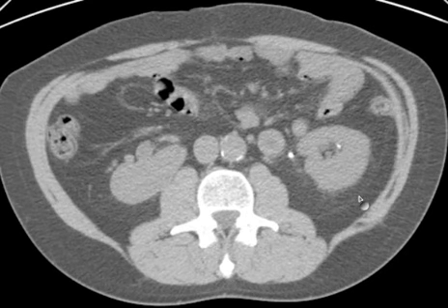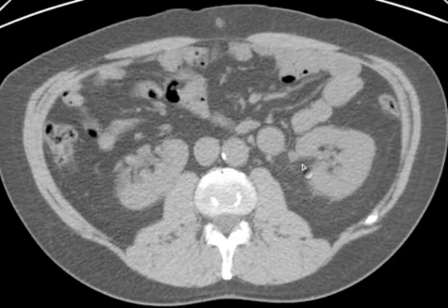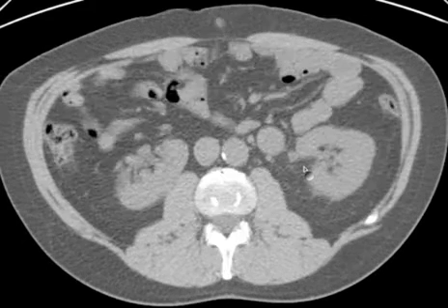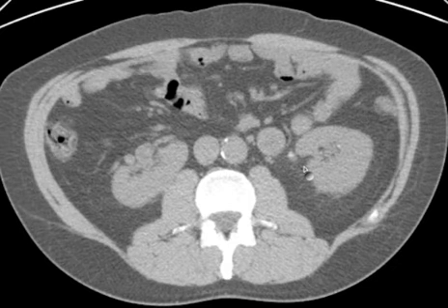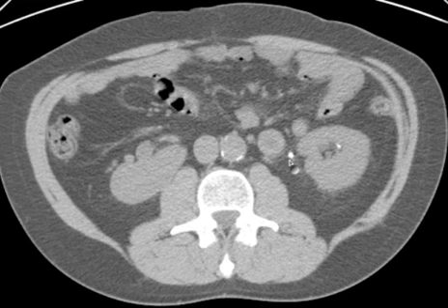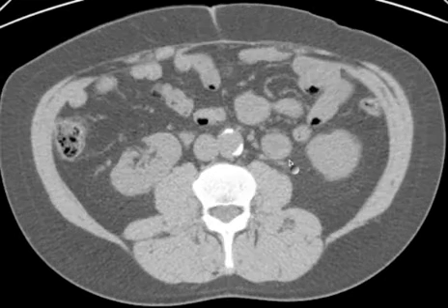But that looks mildly dilated, and you have a stone in the proximal left ureter. At this point, when it's that proximal, you can see this is the renal pelvis here, and if we go down, I would still call this the ureteropelvic junction — basically right where the renal pelvis joins the proximal ureter, the UPJ. So that's a simple finding.